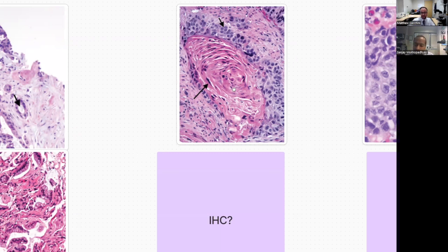So I don't do any immunostains for subtyping this, to tell adeno versus squamous. And for the question of site of origin, there's no point in doing immunostains anyway, because all squamous have the same immunophenotype. The only exception here, Matt, is if there's a P16 slash HPV positive primary in the cervix or in the oropharynx. There I think it's very helpful to do it. I think HPV is the best thing to do here.